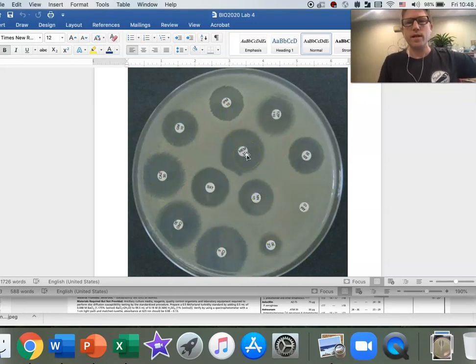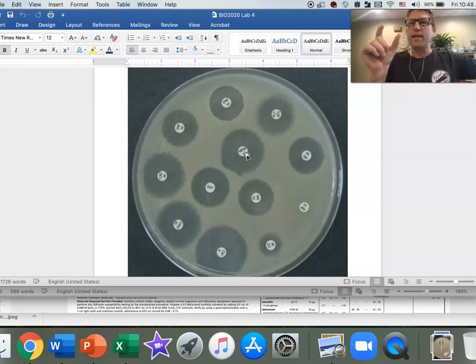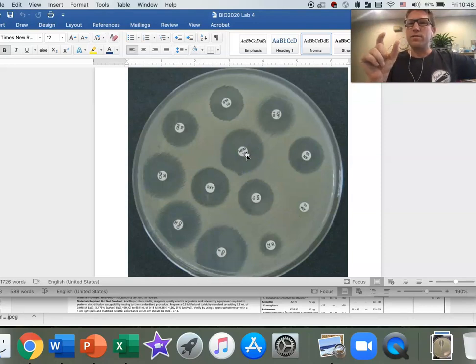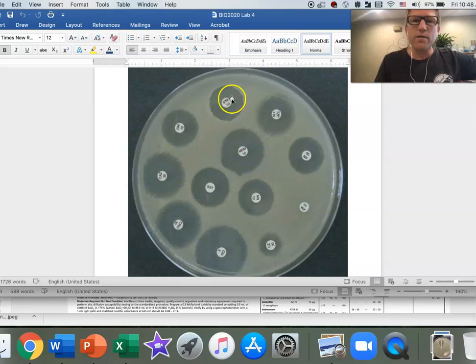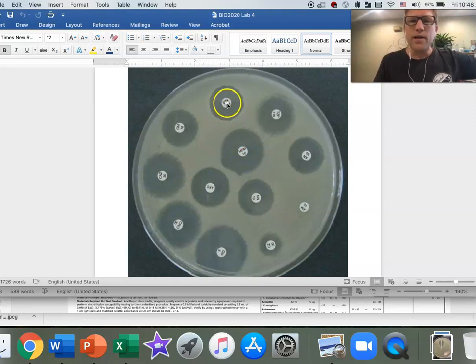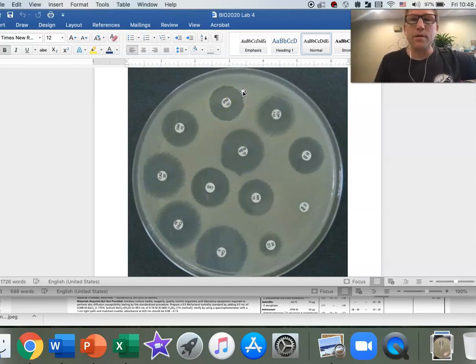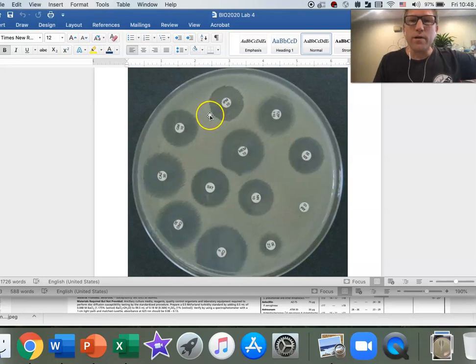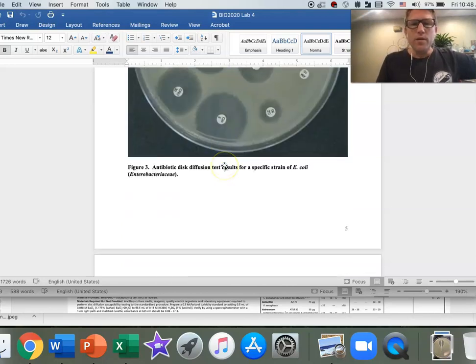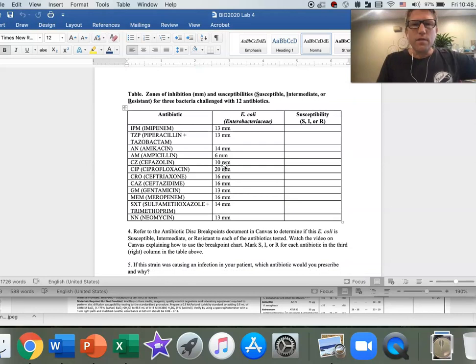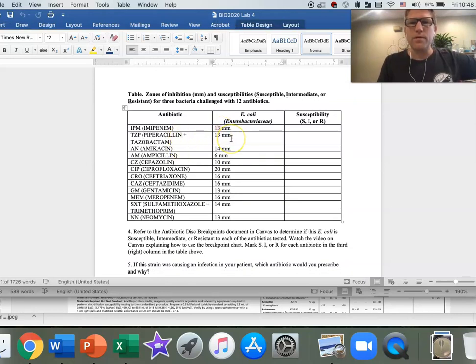What you would do is take either a set of digital calipers or even just a millimeter ruler, and you'd lay it right across. We'll go with imipenem here, IPM. You would lay it right across the middle and measure the diameter from one edge all the way across to the other edge. We know that this particular one measured in at 13 millimeters.